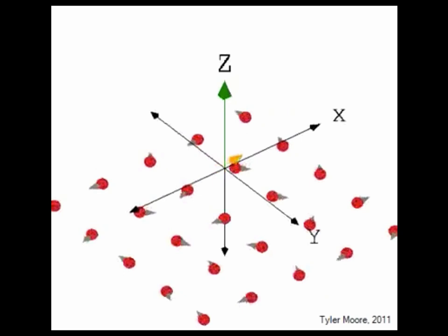This is essentially a fundamental property. It depends on little bits like whatever proteins, electrolytes, or metabolites may be nearby. So between gray matter and white matter, this is one characteristic of the tissue that determines how the tissues look on the scanner, in the final images.